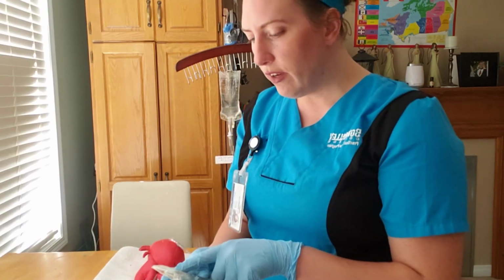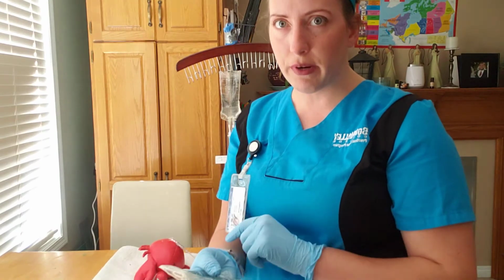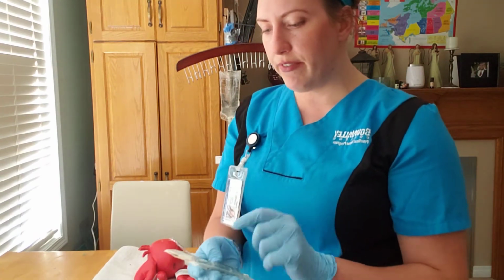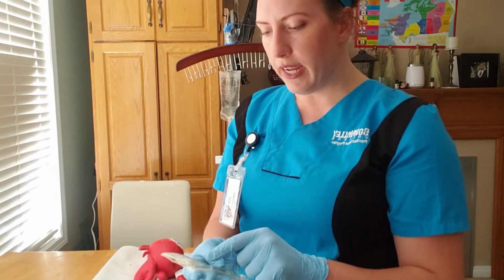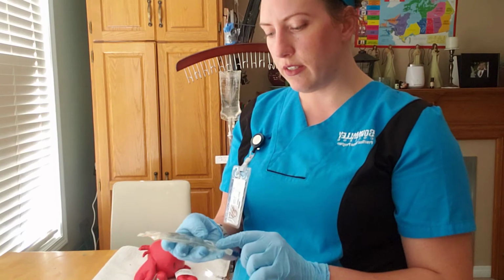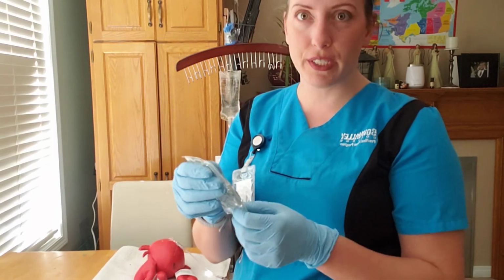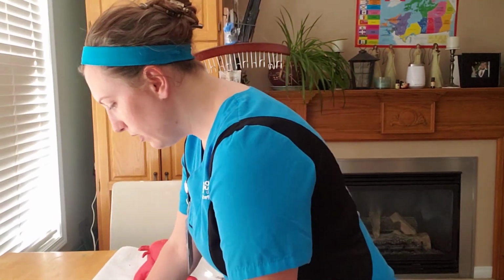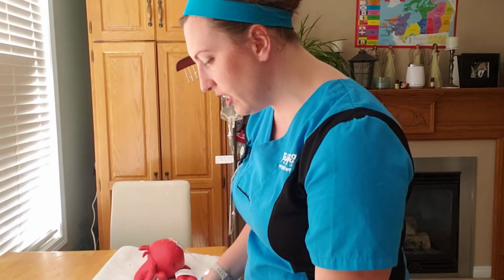Okay, we're looking for 0.9% sodium chloride for injection, so that is the right route again. We've got IVPB on our order and MAR, and 50 mils. So we've got the right volume, the right drug, and the right route, as well as the expiry on this bag is June 21, so it's good we're using it now. It's just about expired.